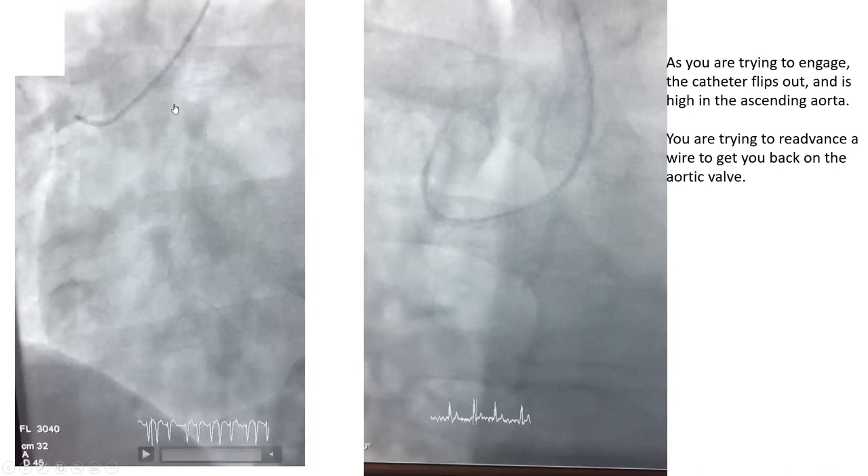Here, you are trying to engage the left coronary. A common thing that happens is the fellow did the wrong torque and the catheter flew out — now the catheter is up in the ascending aorta. The question is how to get it back down to the valve and re-attempt to engage. You need to advance the wire all the way to the valve.